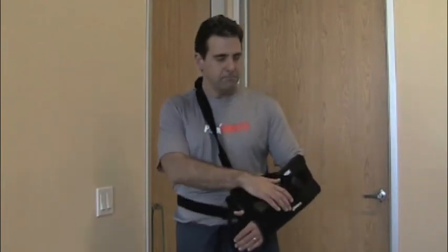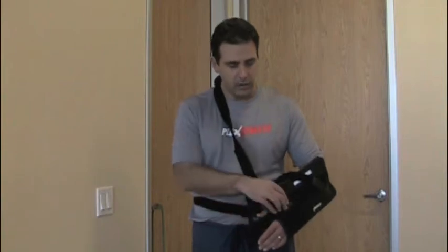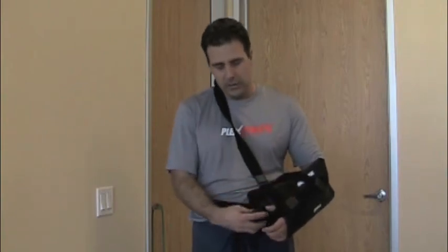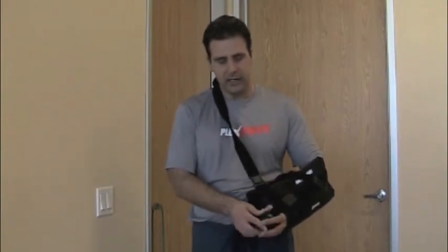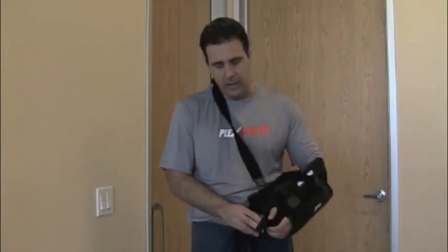Okay. Depending on the type of surgery, it's going to determine how often you need to wear this sling. Most rotator cuffs are going to be in the sling for at least a couple of weeks. As far as exercise you can do in the sling, what I encourage a lot of patients to do, there's a ball here that comes out, and you can actually do squeezing exercises working on grip strength while you're in your sling.